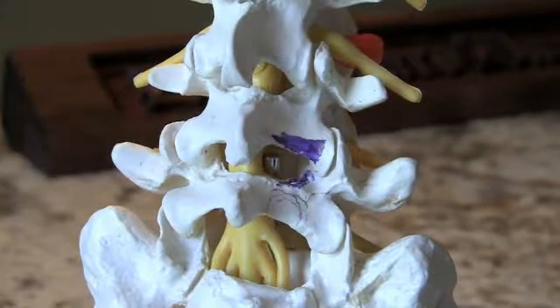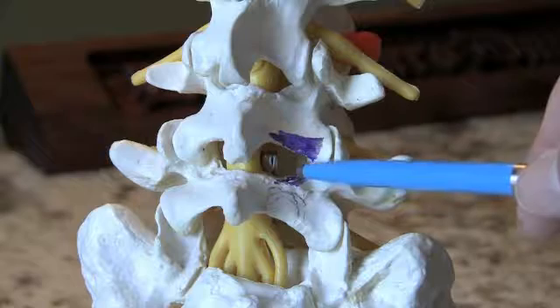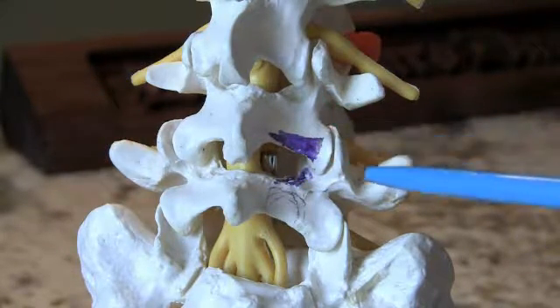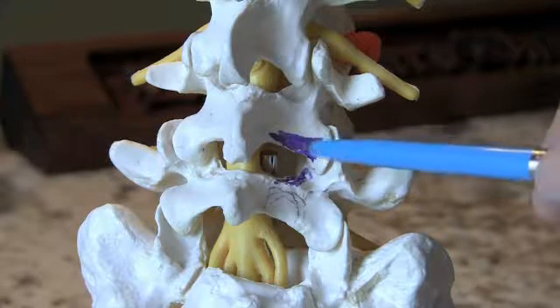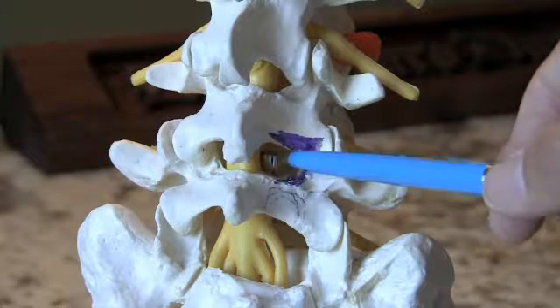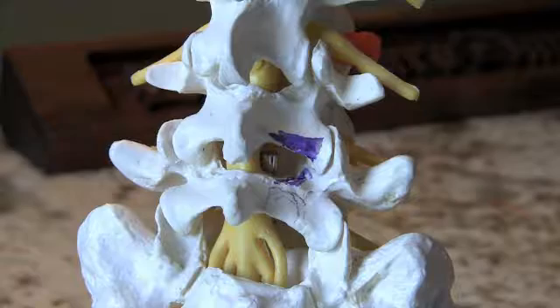In no way typically does this area of bone removal affect the stability of the spine. It's a very, very small area. We leave this joint intact here — called the facet joint — but by making this small opening and bringing the microscope in, we're able to visualize the nerve root there and take out the piece of disc that's pressing on the nerve.